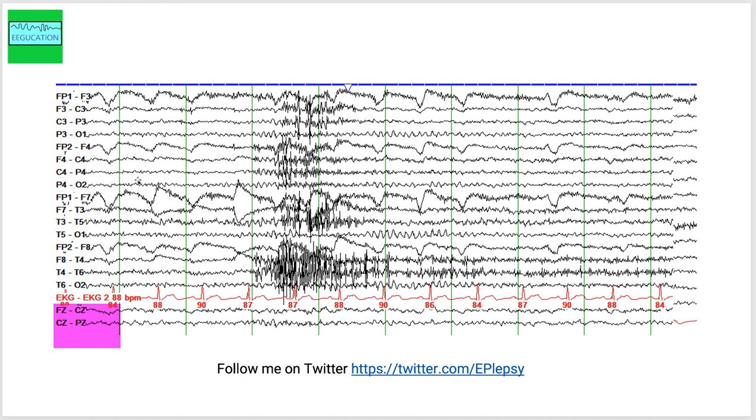These green lines are separated by one second. So I hope that you've seen some of the previous tutorials and you have some idea what the EEG signals are about.